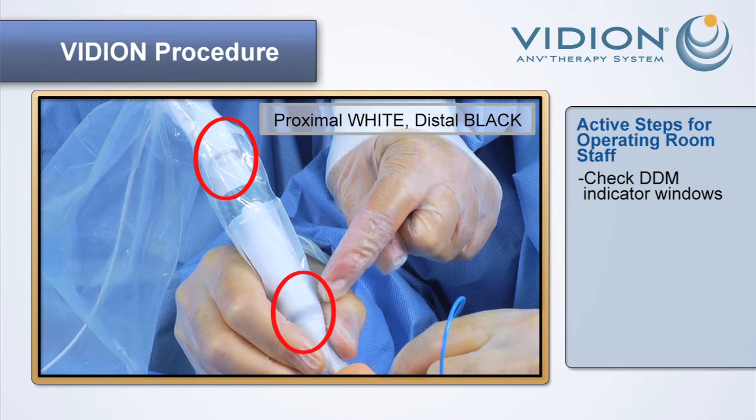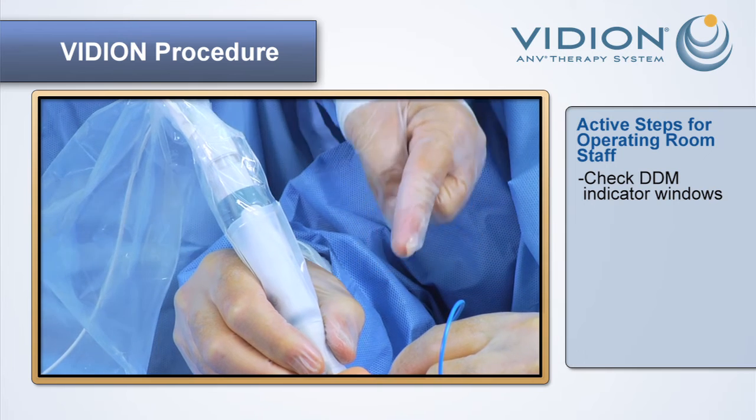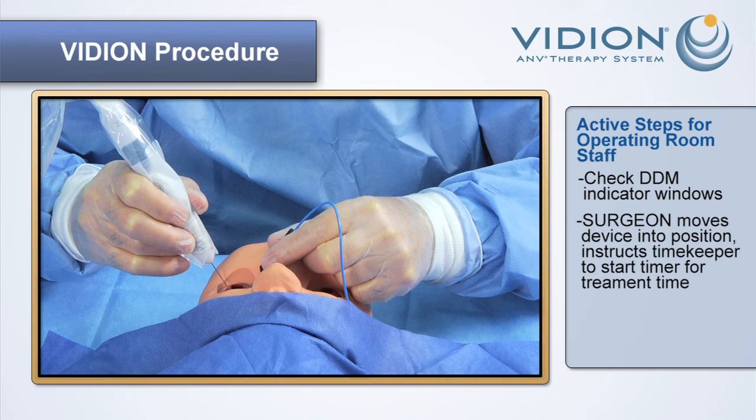from white to black. The retinal surgeon then moves the device downward until the applicator tip is in the correct position and then notifies the appointed timekeeper to start the timer for the treatment time selected. Treatment time should start when the disposable applicator tip is placed in position on the retina.